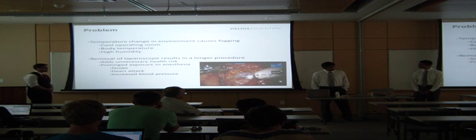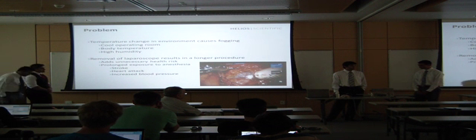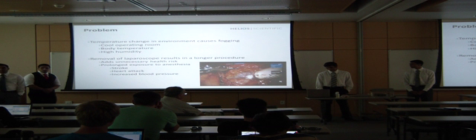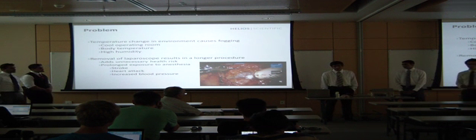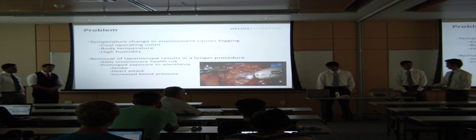Now, as you can see, this delays the surgery for a good amount of time and could create complications such as stroke, heart attack, and increased blood pressure. So our group saw this as motivation to create a tool which eliminates the fogging and the delay.